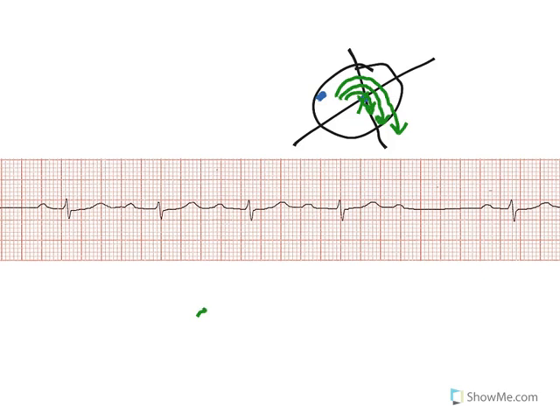Let's look at this one right here. If you measure out your PR interval, I'm using green, but that's okay, it's already a really kind of delayed PR interval as is, but let's count the boxes. We got 1, 2, 3, 4, 5, 6, 7 little boxes. I usually just do 7 times 4 is, wait for it, 28. Very nice. So those of you who answered correctly, good for you. That tells me that it's 0.28 seconds. Well, we already know that's too long. We want it to be within 0.20 seconds.